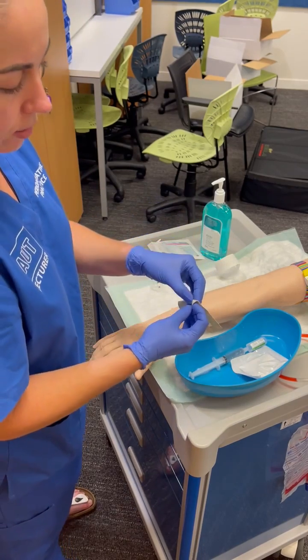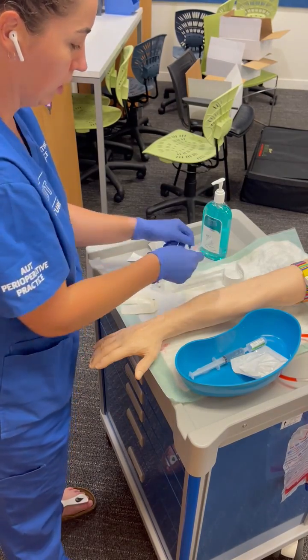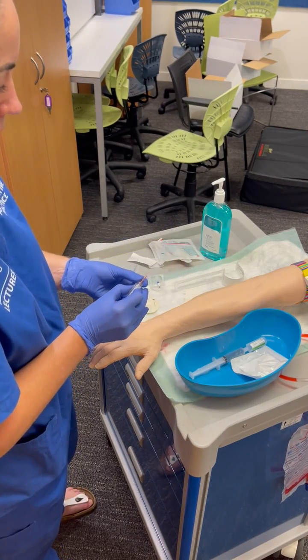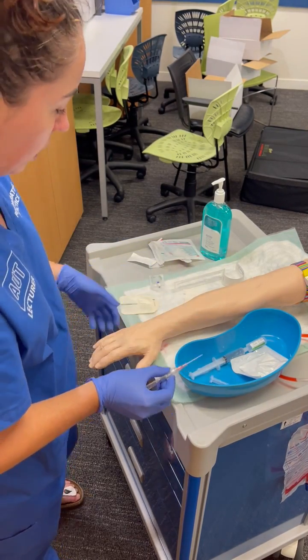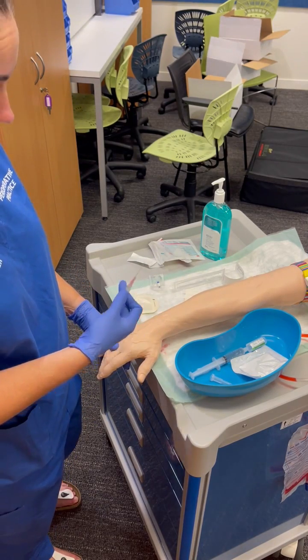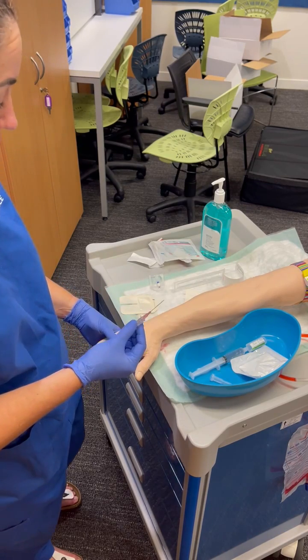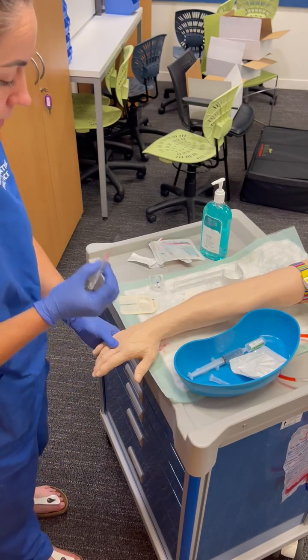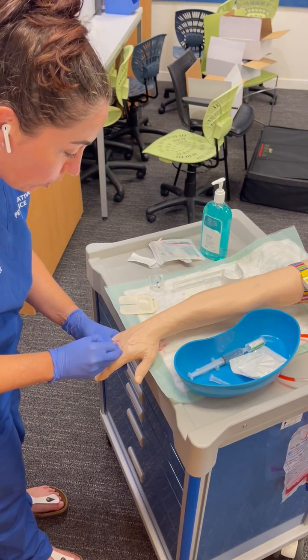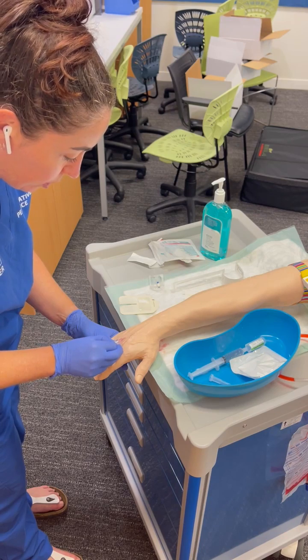I find it easier to pull apart the IV tegaderm at this point because I'm going to need the wings first. This isn't a human so the alcohol is still a bit damp, but in a normal human that would have dried. I'm tensioning the skin — sharp scratch coming up now, quite shallow because it's a superficial vein. Watching for a flashback.